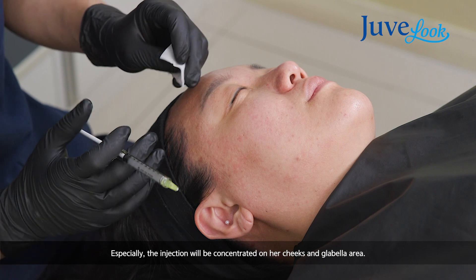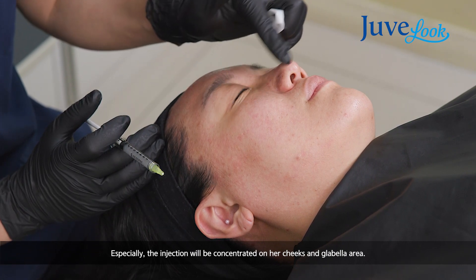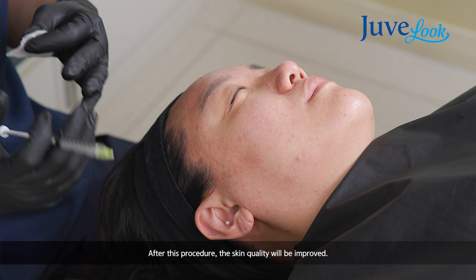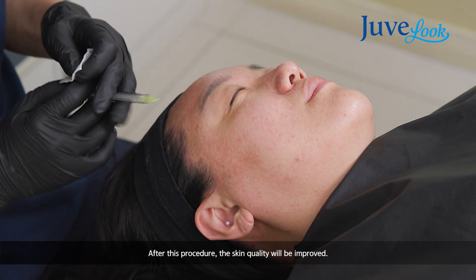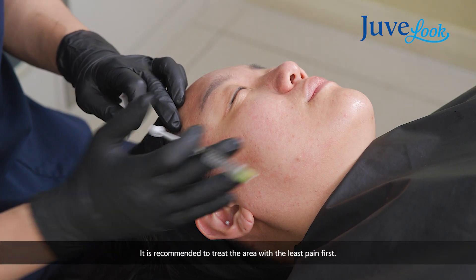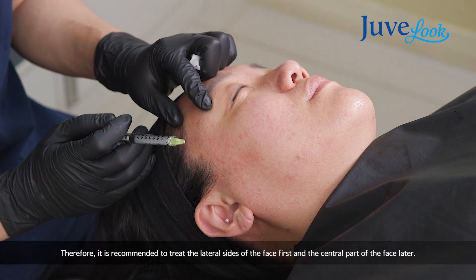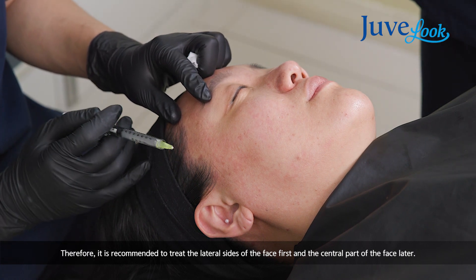Usually this central part of the face, patients feel the most pain compared to other areas. So I start from the less painful area, which is the lateral side. A vibrator is quite helpful because this is a quite painful procedure.